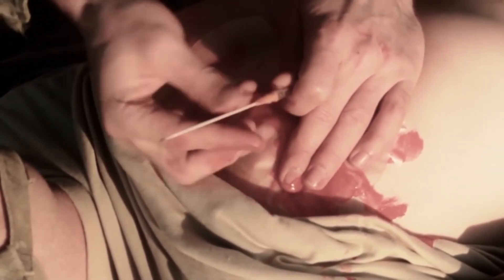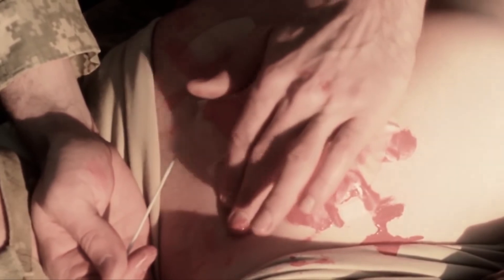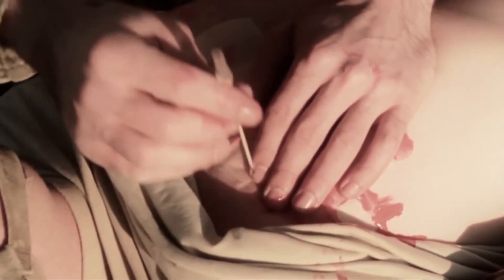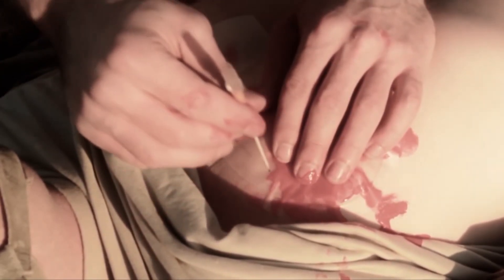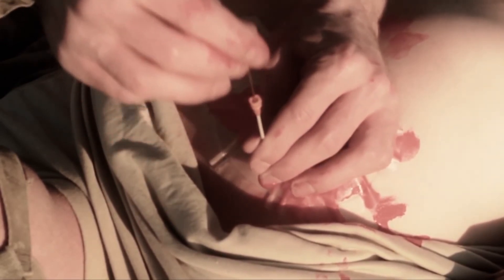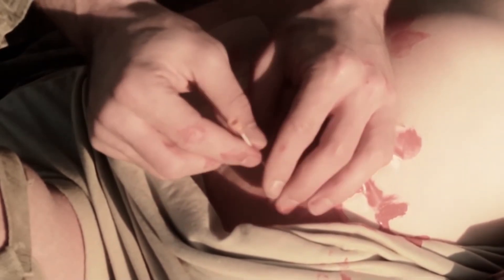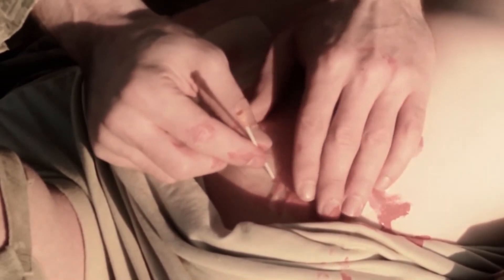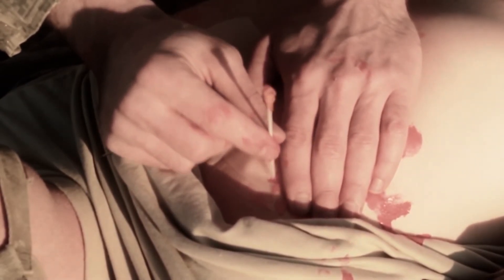Insert the needle catheter. Firmly insert the needle into the skin, slightly above the top of the third rib into the second intercostal space at a 90 degree angle. Continue inserting the needle with its catheter covering all the way to the hub. You will feel a pop as the needle enters the chest cavity. A hiss of escaping air under pressure should be heard. Continue advancing the needle catheter all the way to the hub. Withdraw the needle while holding the catheter in place. The catheter will remain as a means for air trapped in the chest to continue to escape to the atmosphere. Secure the catheter with a strip of tape.